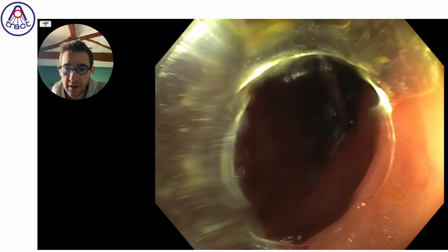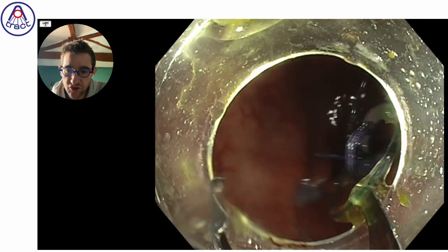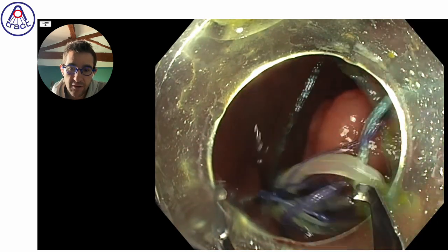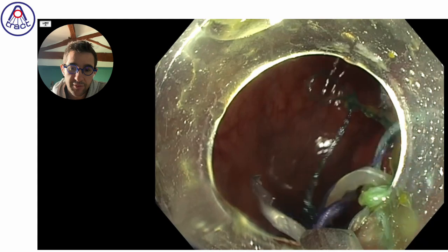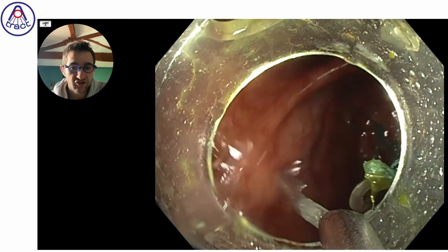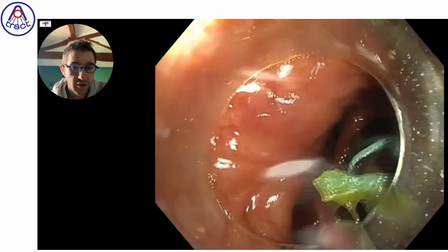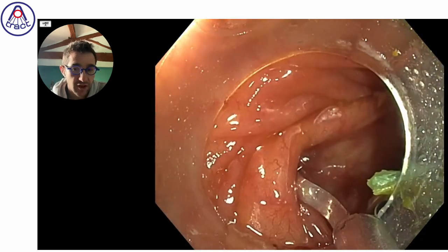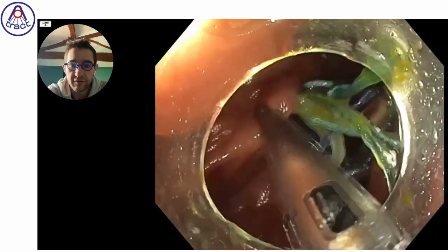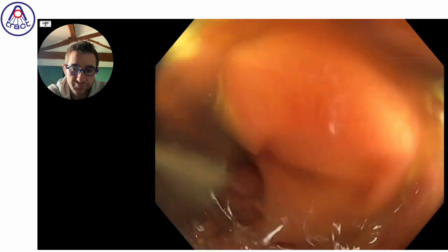So once again, another solution could have been to do first the cecal incision and immediately put the traction on this area when it was easily visible, before doing the injection on the oral edge, because this injection on the oral edge is very good for incision, but on the opposite, makes the lesion turn to the cecal side and therefore prevents a very good visibility of this area.